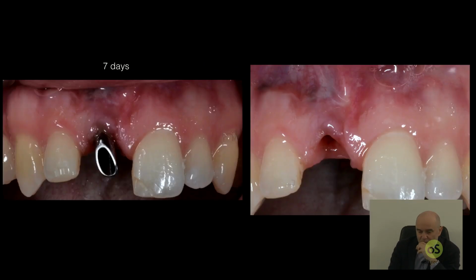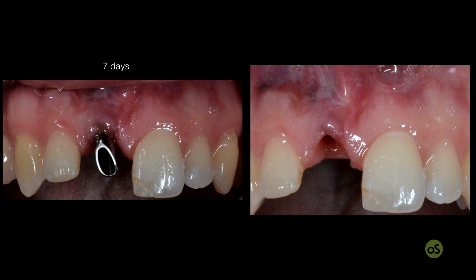So now we can see the step-by-step procedure of this clinical case. And I want to share with you the picture only 7 days after removal of the crown and change of the abutment.